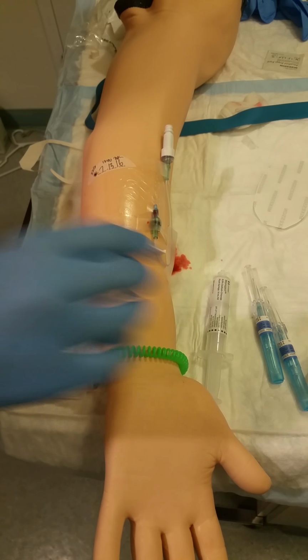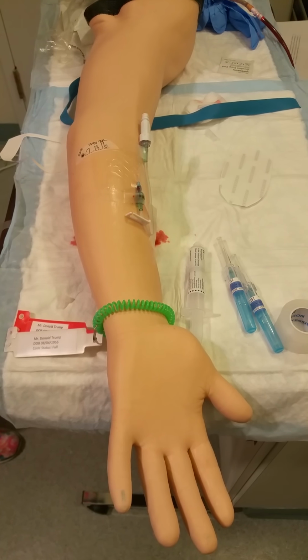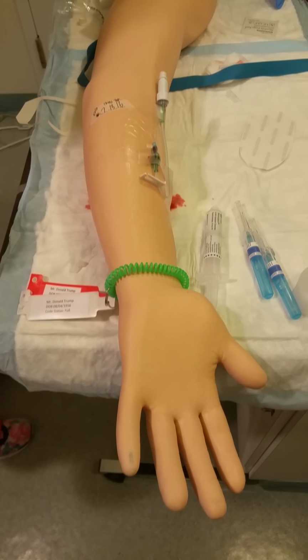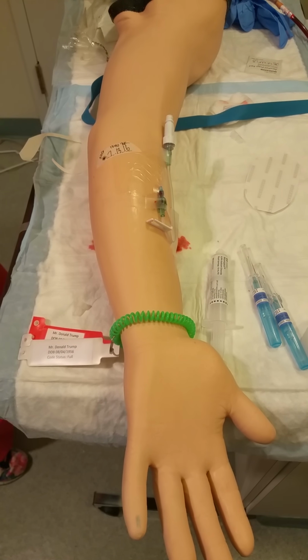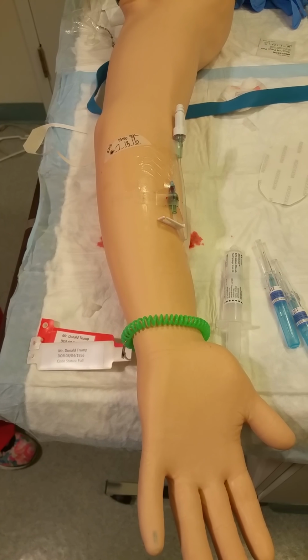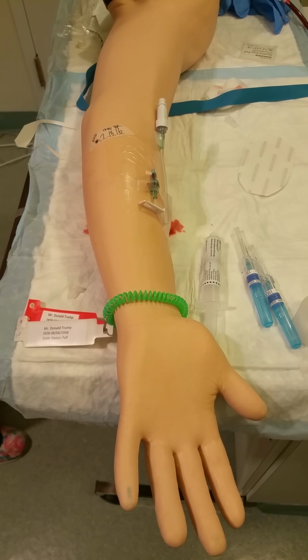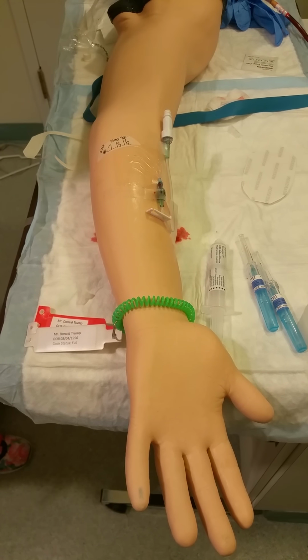I'll clean up all of my supplies and make sure Donald's in a comfortable position. I'll lower the bed to its lowest position, give him his call light, advise him to call me if the site becomes painful, if he notices any warmth, redness, or swelling there, and I will go out and document my procedure. The next thing I'll do is go to the pharmacy and gather my 0.9% normal saline and come back and begin Mr. Trump's infusion.